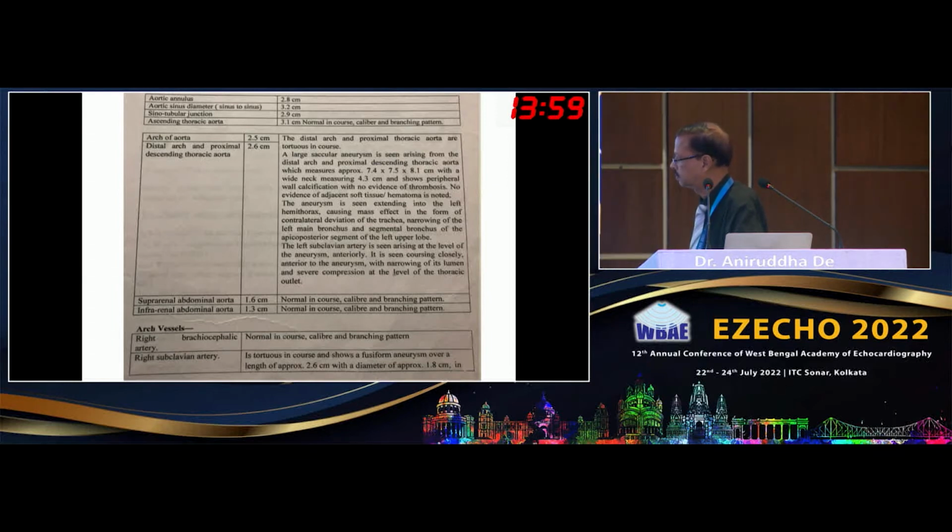The whole wall is calcified. It will be tough for me to say that it is a true aneurysm simply based upon the neck, whatever the width. This location is typical of a pseudoaneurysm. Agreed, sir. The other thing is that nine out of ten times a mass like this would be a pseudoaneurysm of the descending thoracic aorta.